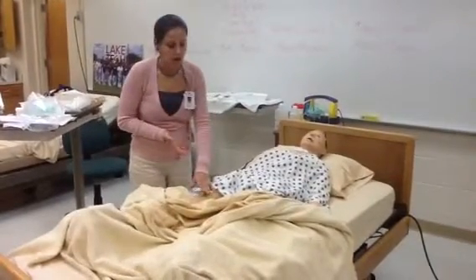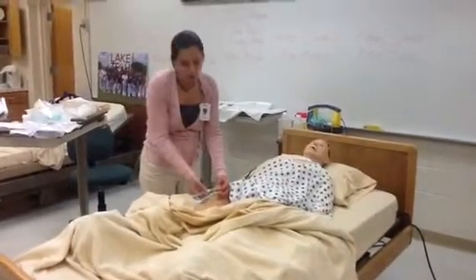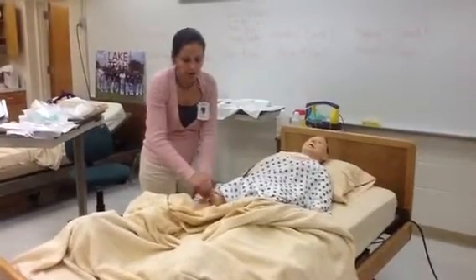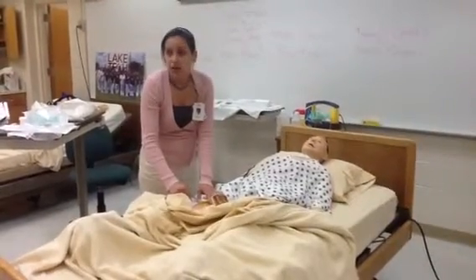All right, but if we are relegated to just using tape, we need to make sure that we have a piece of tape at the leg and then a piece of tape over this area so that this Y is not getting stuck. Okay?